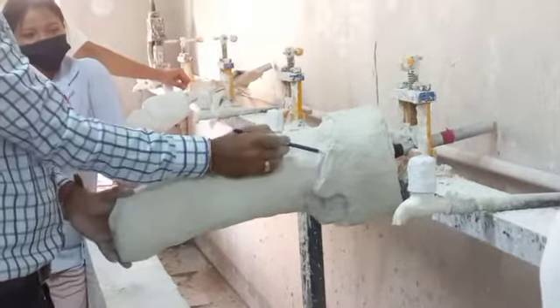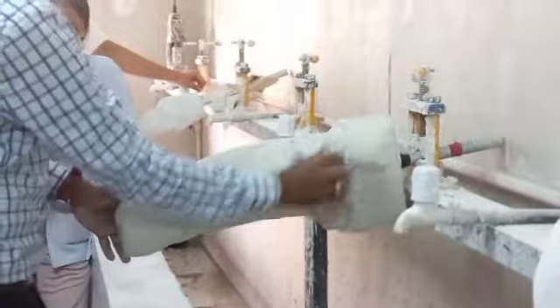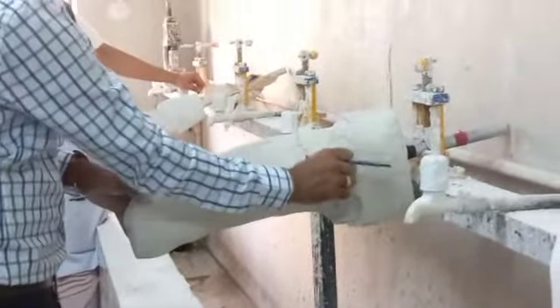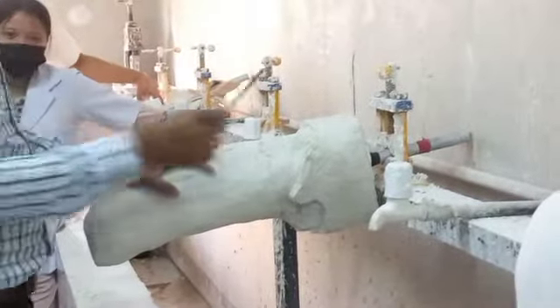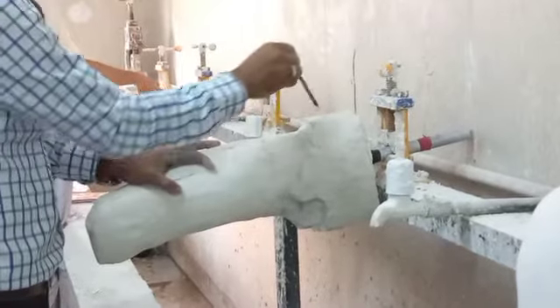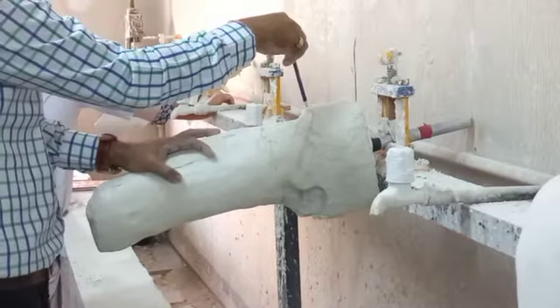And then where is our lowest point here? It's very much clear by our cast. During casting, this area of wrap is done. So this is very much clear about the lowest point. There is a diagram drawn in the manual that was given to you. In that diagram, they have shown that from there, 4 centimeters down, then they did something.